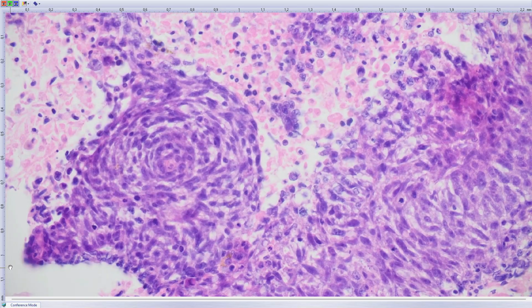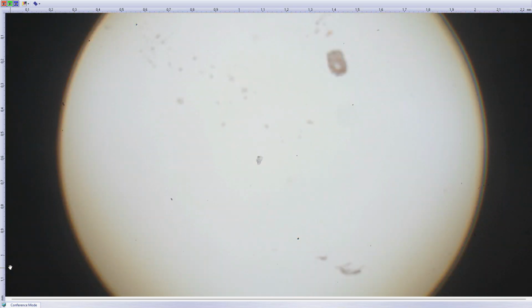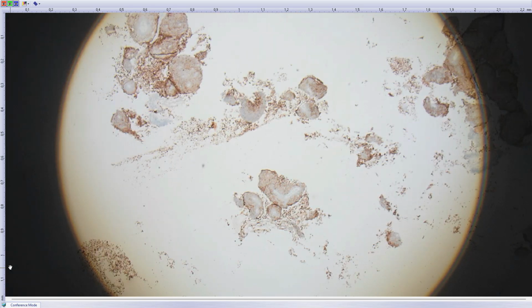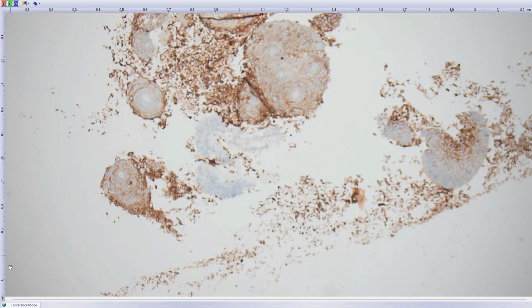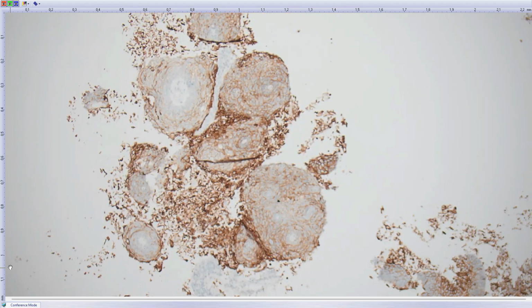There is cross-reactivity between GFAP and cytokeratins. So I performed Claudin 4 and MOC 31 staining. Both were positive, so the lesion must be epithelial. And then I started to think what kind of epithelial neoplasm it could be.